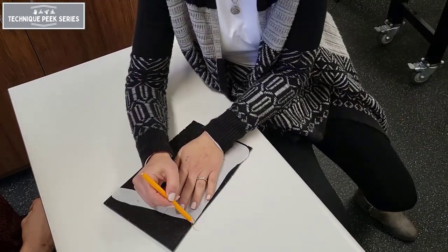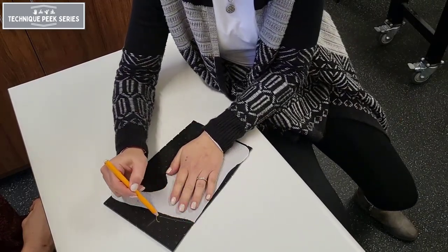Next, we'll trace the pattern onto our material using a splint marker.